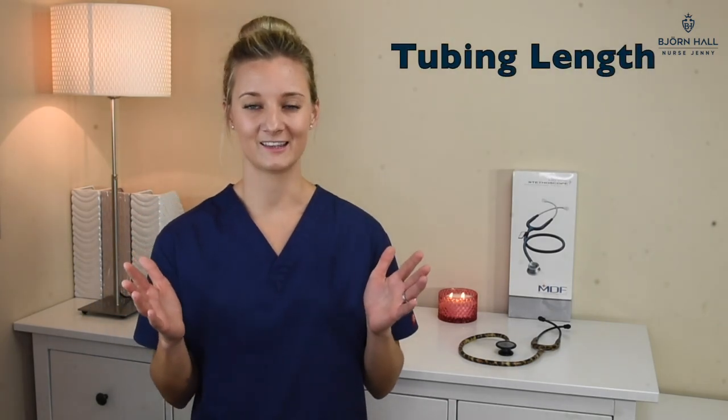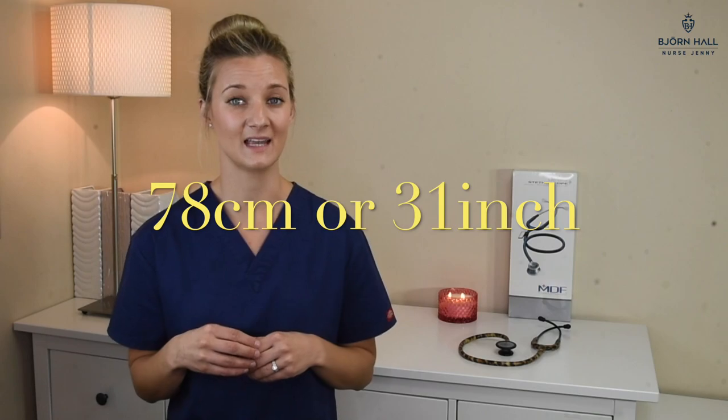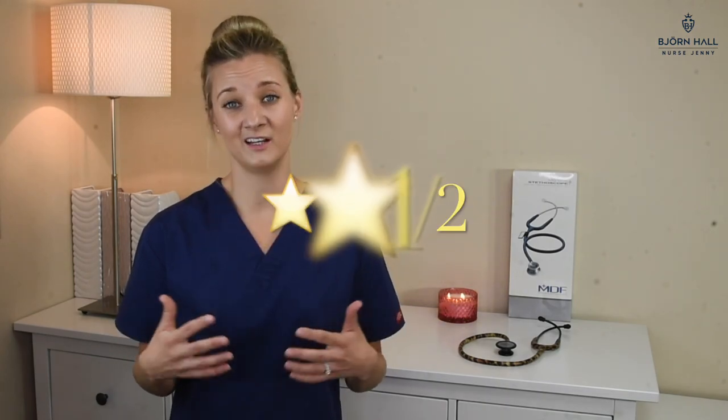Tubing length. The length of this stethoscope is 78 centimeters, or 31 inches. As mentioned before, it is too long for my personal preference and I've given it two and a half stars out of five.